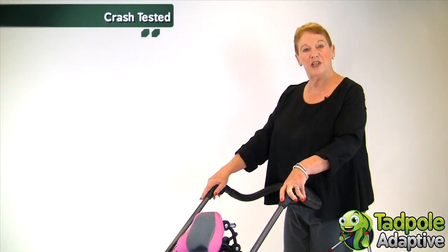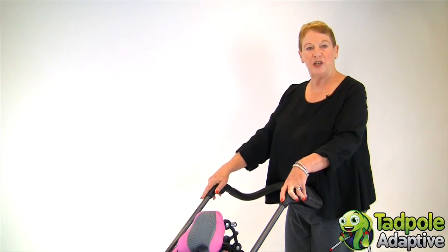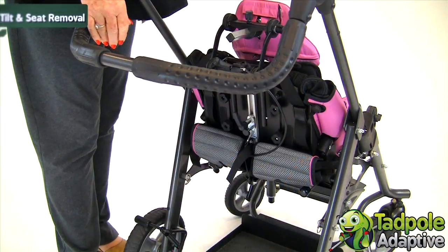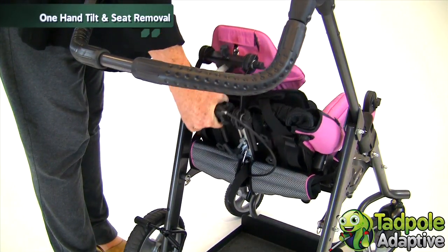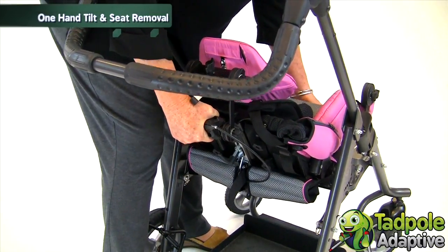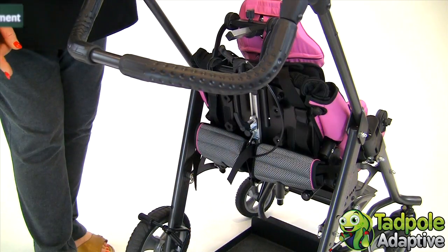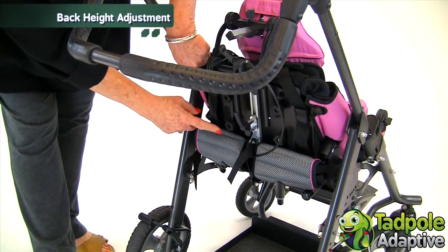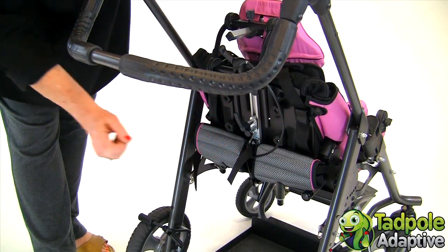T-Ride is crash tested and approved for safety and transportation. What makes T-Ride really unique is that with one hand, you can adjust both the tilt and space and lift the seat off of the chassis. You can adjust your back height by 5 inches simply using the knobs located here and here on the back of the seat.